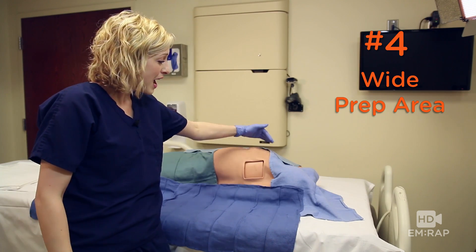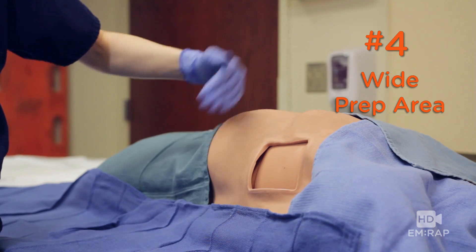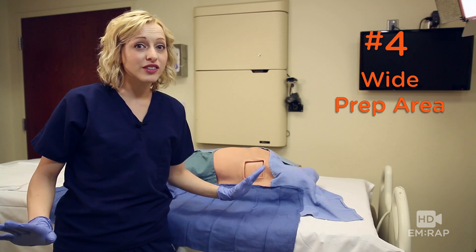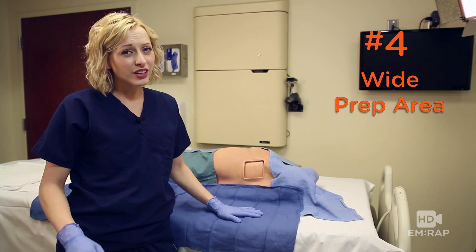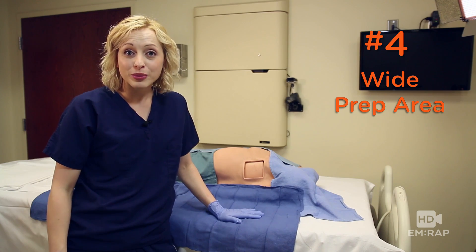Number four: prep and drape a wide margin — from clavicle to costal margin, from sternum to mid axillary line. This keeps all of your landmarks in view during the entire procedure and reduces your chance of placing an intrasplenic chest tube.